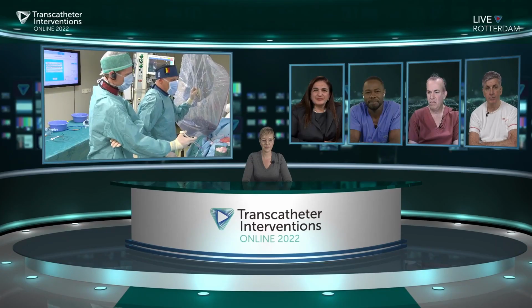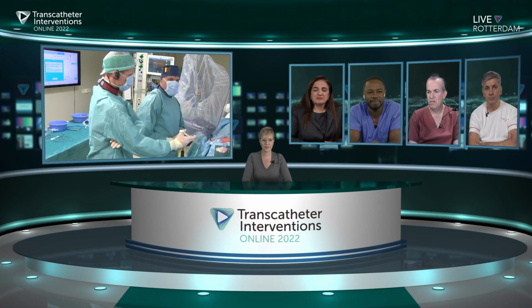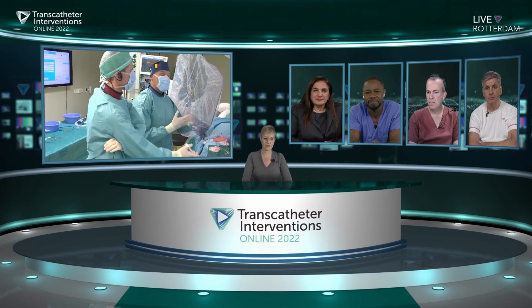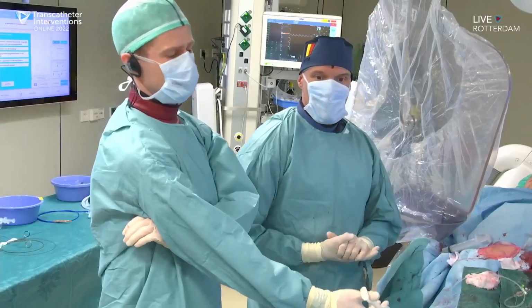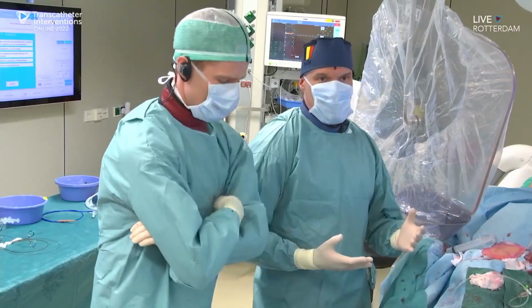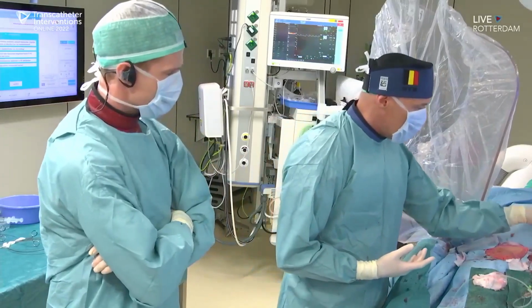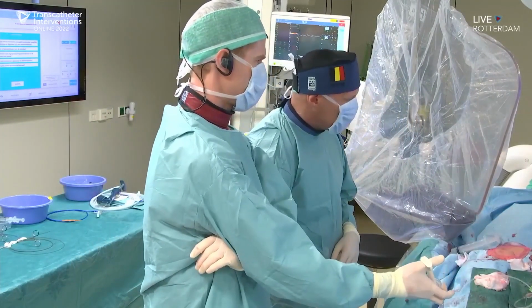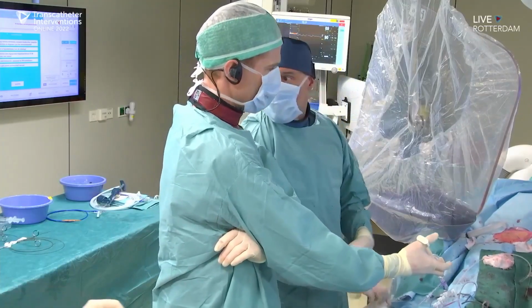No, I think here you have to be prepared for some bailout options, and there is no bailout option when you use a Manta device other than a covered stand. So we want to try to avoid a covered stand. That's why we would not prefer to use a Manta here. Can we move the screen distally, please?